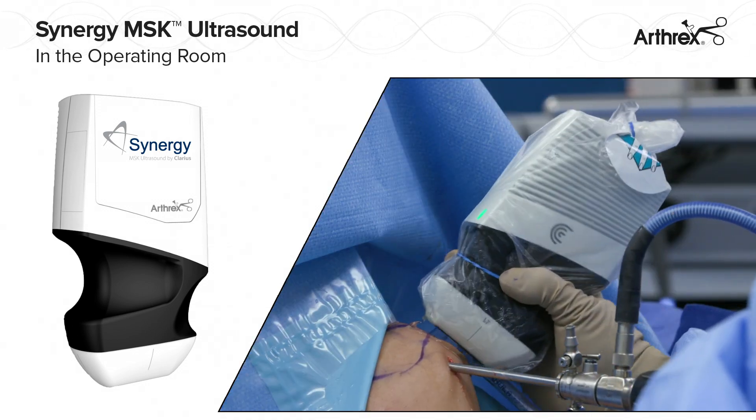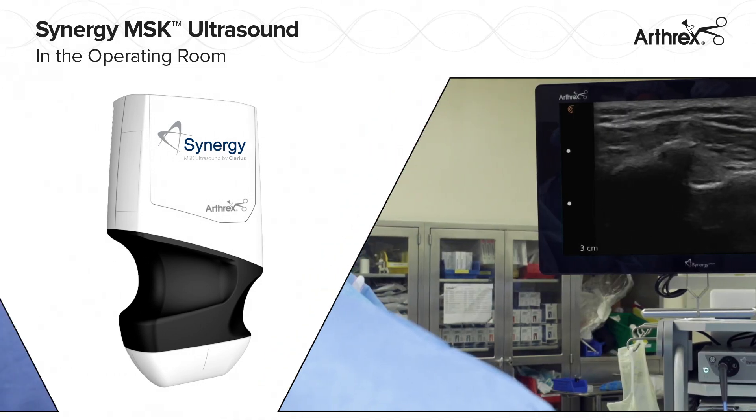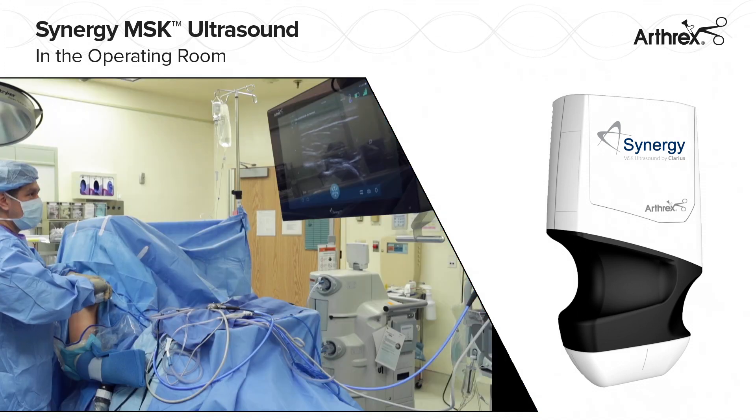The Synergy MSK Ultrasound is easily draped for use in the OR to locate loose bodies, image superficial anatomic structures, and provide precise guidance of soft tissue repairs such as biceps tenodesis, MPFL, and ALL.